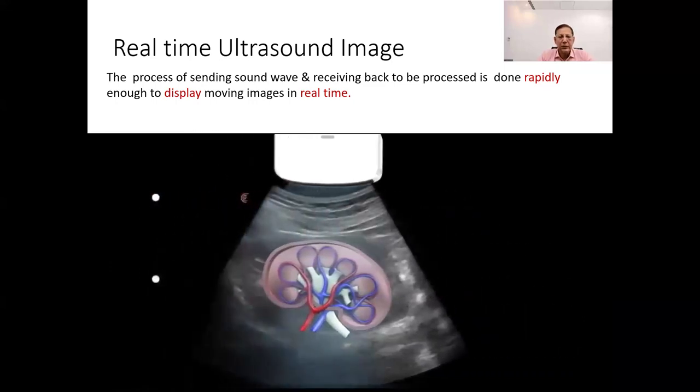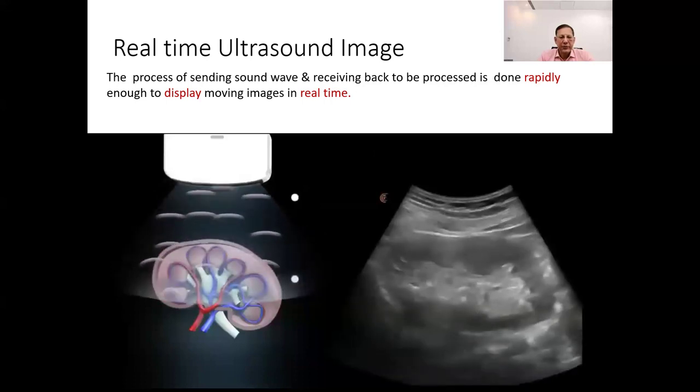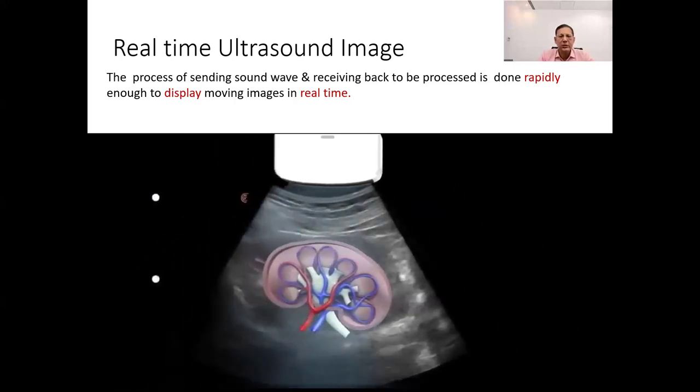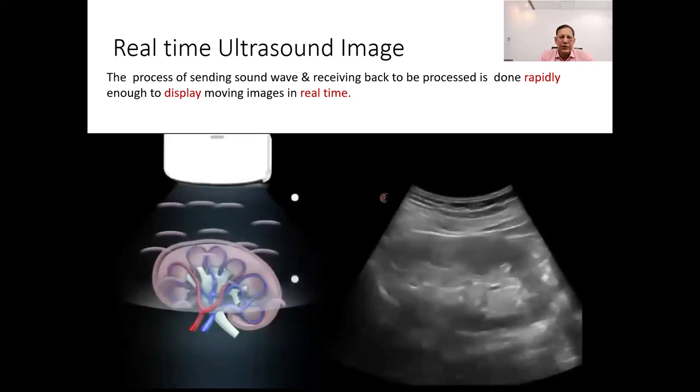Nowadays, in modern ultrasound systems, operators can often adjust the settings related to scan lines, such as depth, focus, and beam width. These adjustments allow for optimization of the image quality and visualization of specific anatomical structures.